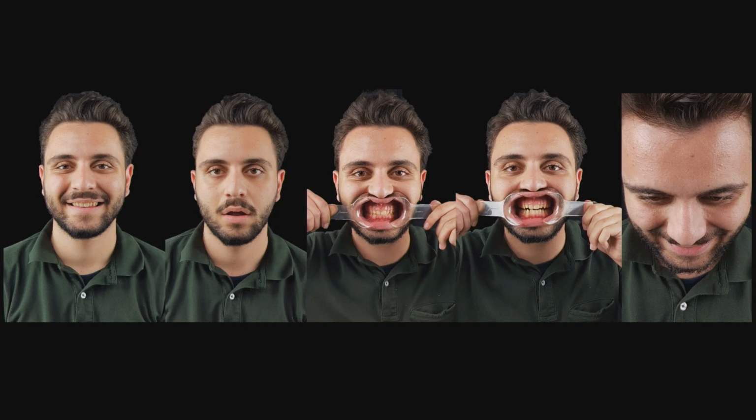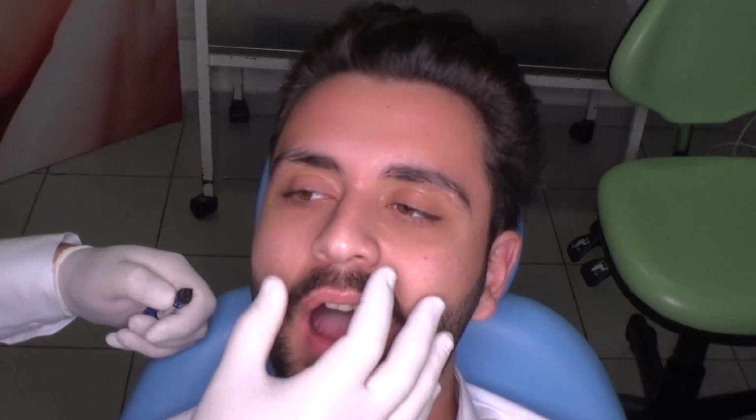And now is the time to put a single composite on the central incisor. It shouldn't be the best composite that you can do. It just should be a small piece to define the new incisal edge position, a new vestibulolingual position of the teeth. To have some reference points. Open a little bit in rest.